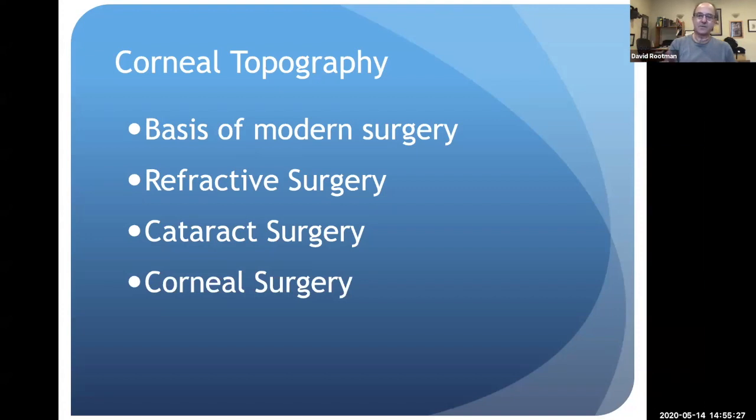It's usually very, very close to what we expect. But it's a wavefront device. You know, there's different ways of measuring a wavefront, and the retinoscope is a primitive wavefront device. It's a damn good wavefront device, and I'm sorry that we don't use it more often now. We've moved away from it. But it gives you the entire optical system from the surface of the tear film to the macula, everything. So if you take the placido, which gives us the curvature of the anterior surface, and subtract the anterior information, it leaves you with everything going on behind the cornea. The posterior surface of the cornea, anterior surface of the lens, posterior surface of the lens, foveal curvature, all of that. So that's what the internal OPD gives us.